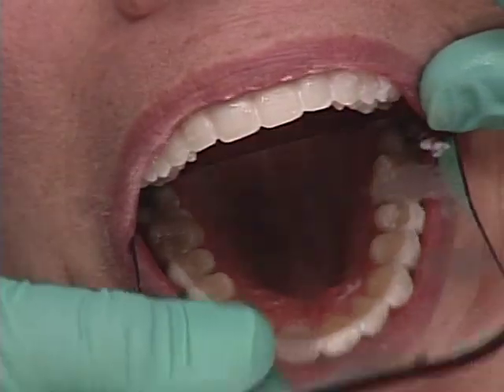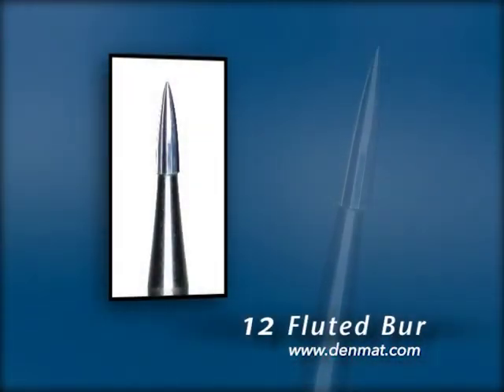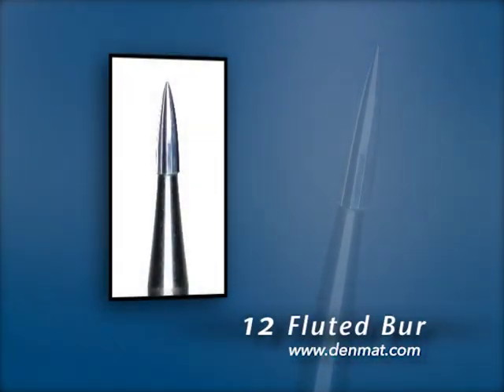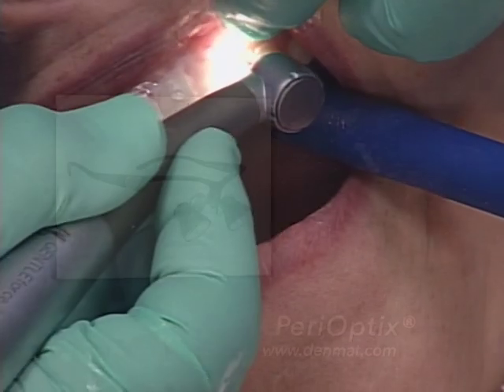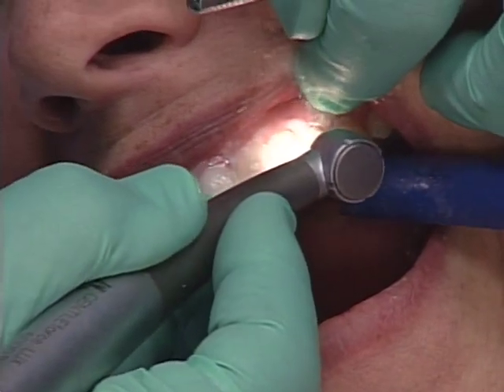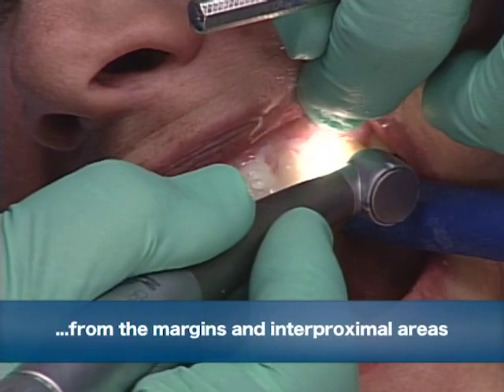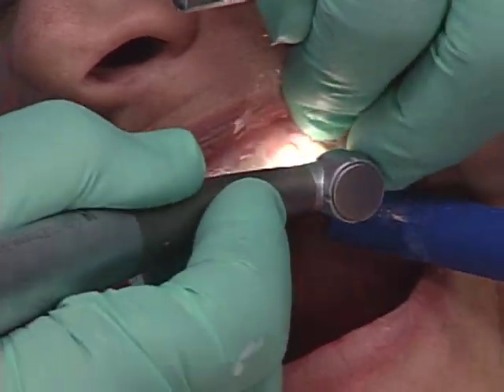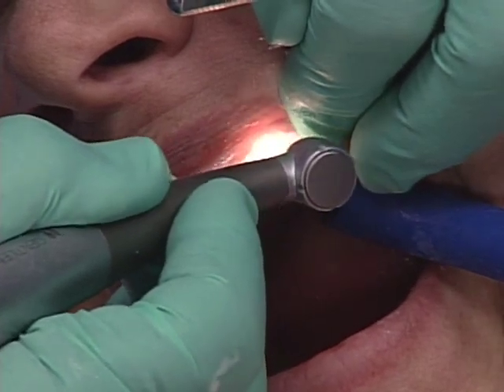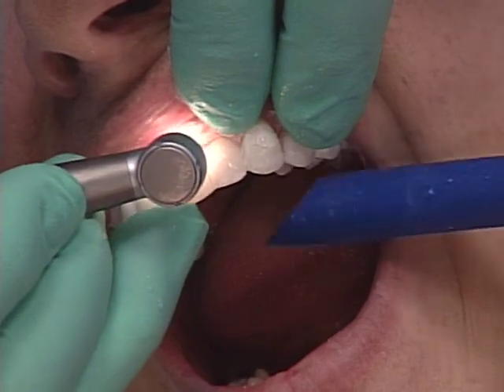So now we're about 80% finished on the lingual side. And then we'll take the 12 Fluted Bur to remove the Ultrabond. I just come back in with my magnification, and I can tell you the visibility is like, I don't know if anybody's ever done any scuba diving, but if you try to look at something under the water, and then you dive in and you've got your face mask on, everything looks different and much clearer. And I just define these interproximals.